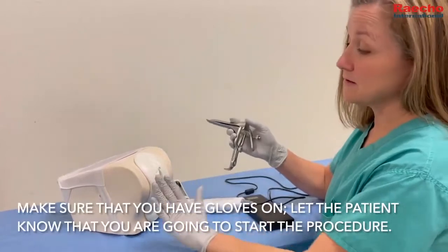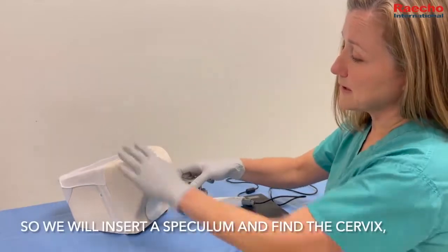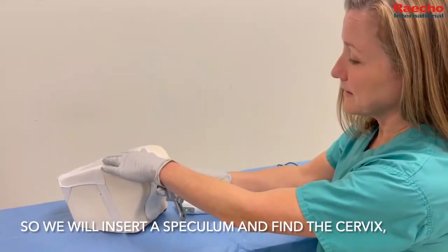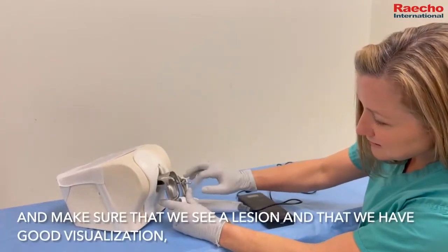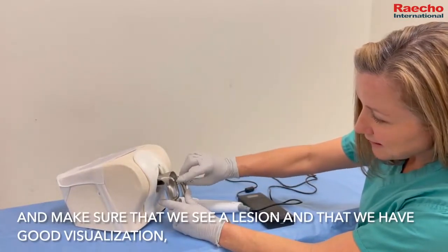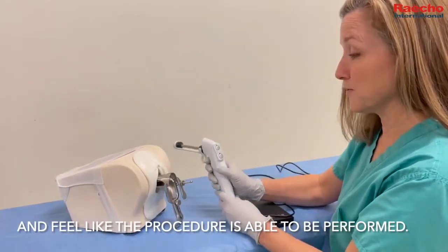Make sure that you have gloves on and let the patient know that you're going to start the procedure. Insert the speculum, find the cervix, make sure that you see a lesion, that you have good visualization, and feel that the procedure is able to be performed.